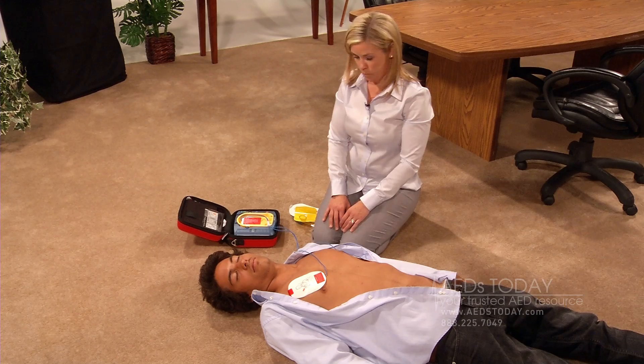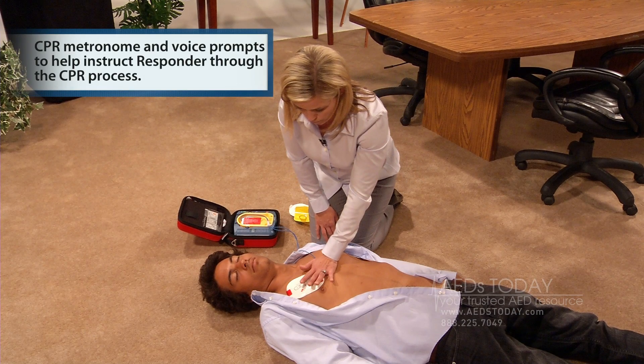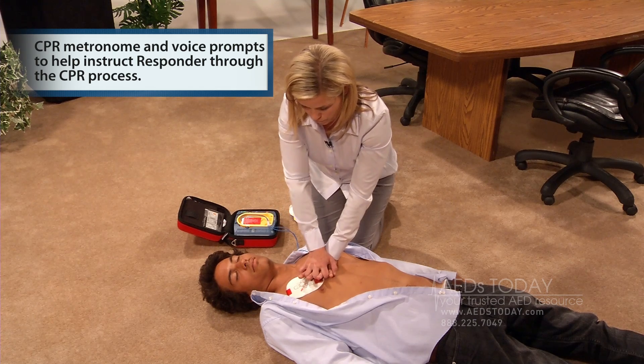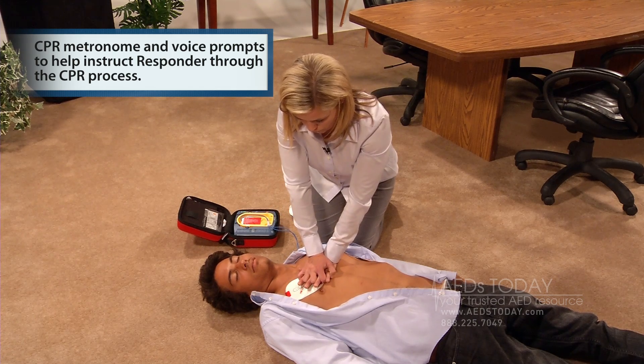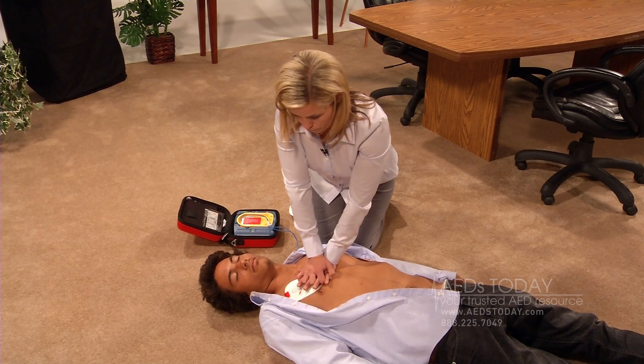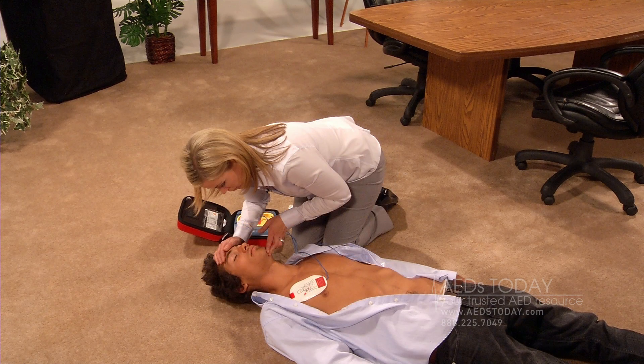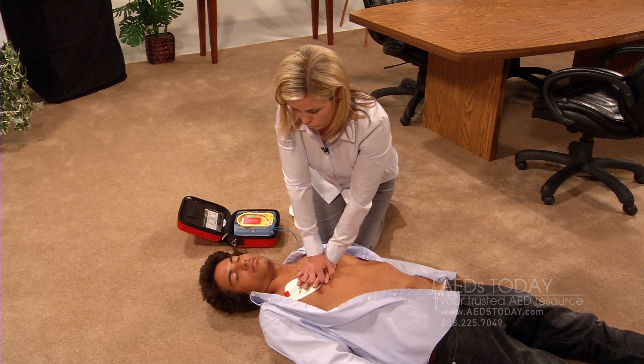Place the heel of one hand in the center of the chest between the nipples. Place your other hand on top of the first. Push the chest down firmly two inches. Keep time with the beat. Pinch the nose, tilt the head, and give two full breaths. Breathe. Breathe. Continue with compressions.